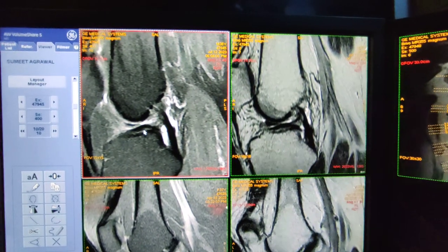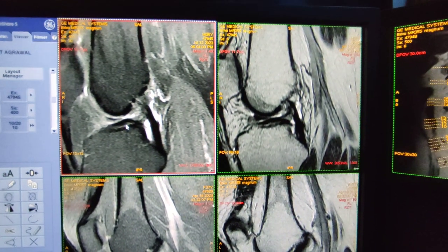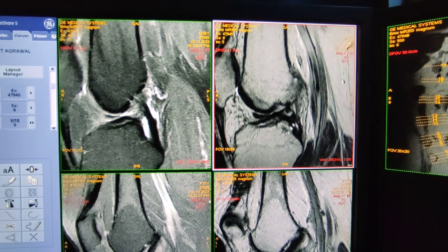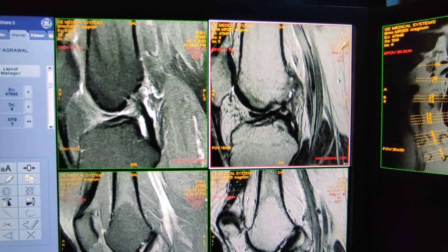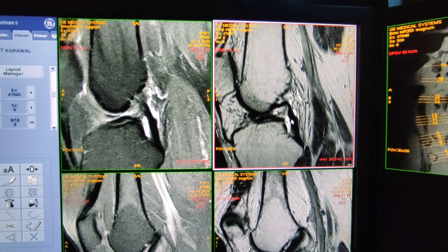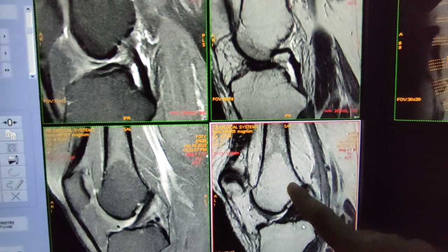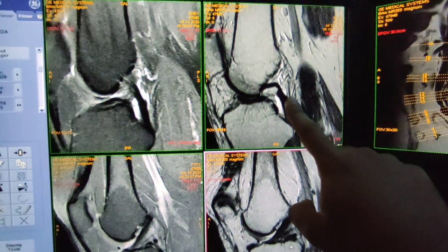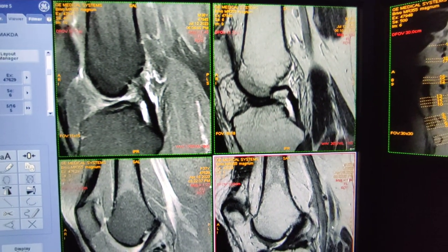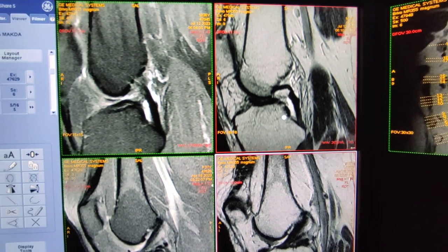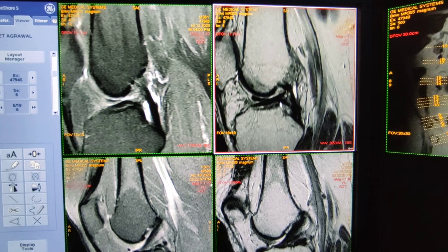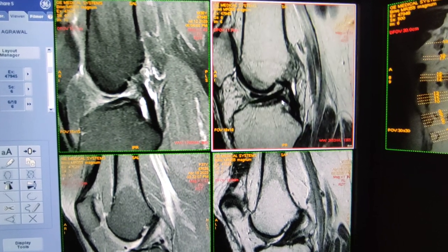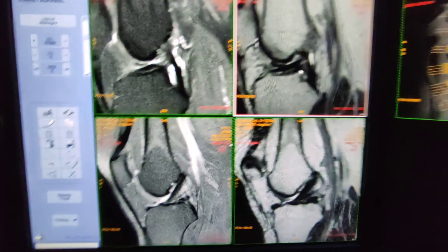In the same manner, this is the T2 weighted sequence. Here also we can say there is discontinuity of the ACL at the femoral attachment. In this sequence we can see the femoral attachment, and in this sequence there is no ACL at the femoral attachment.